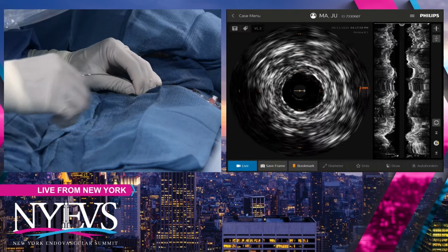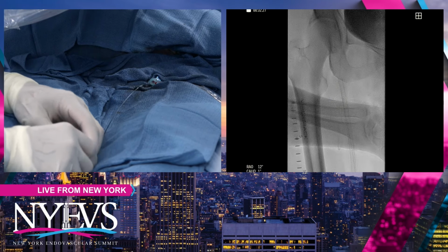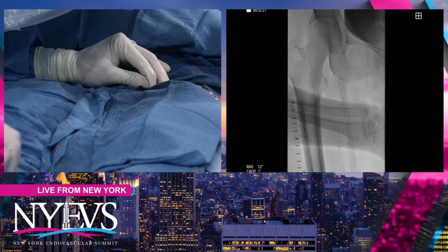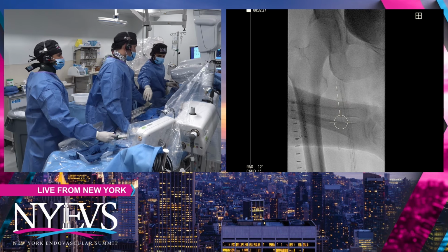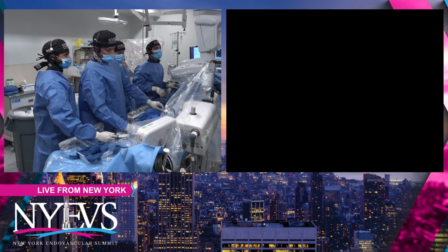So I'm going to quickly show you pictures, and then I'll ask the panel what their thought process is on how to treat these so-called three segments. We already did the main ISR. Hopefully that got fixed. But the origin, the middle segment, which we showed on IVUS, and distally as well. But any comments on the IVUS per se? We'll give you quick pictures right now. Go for it. Ready?